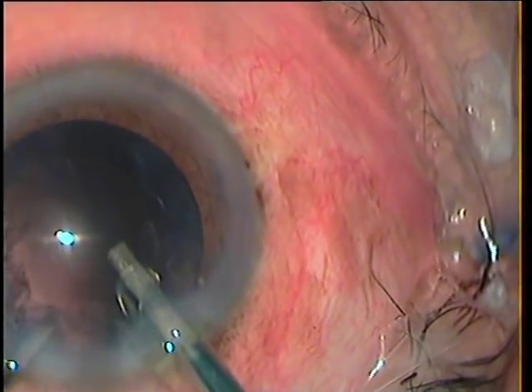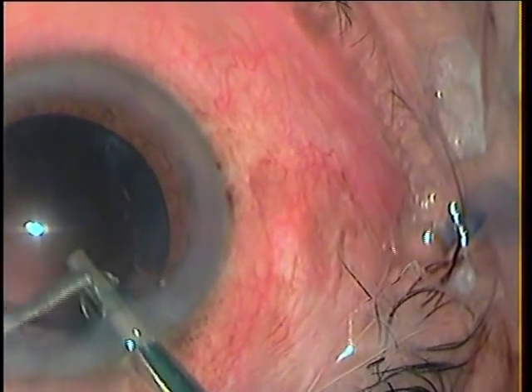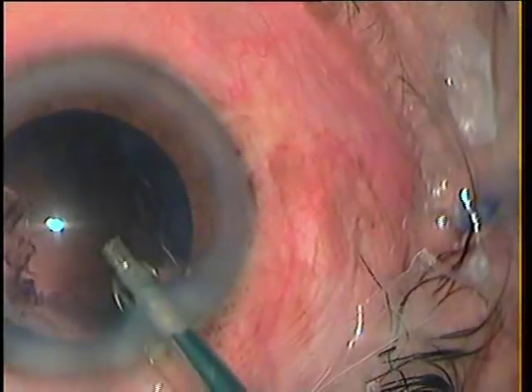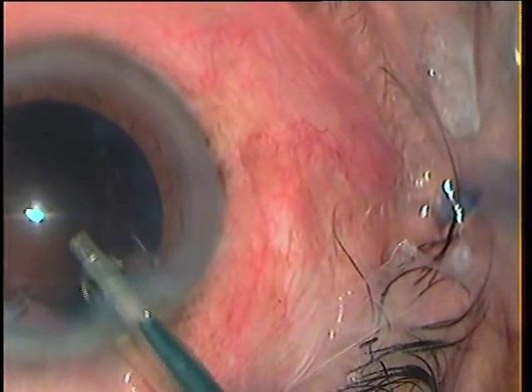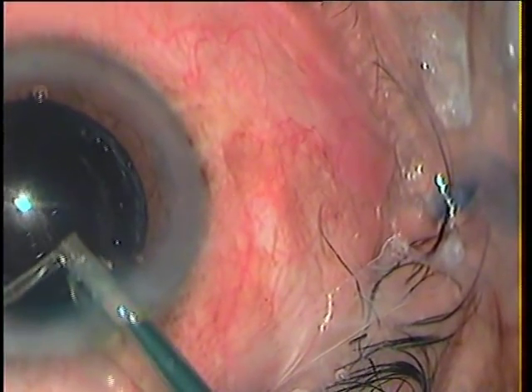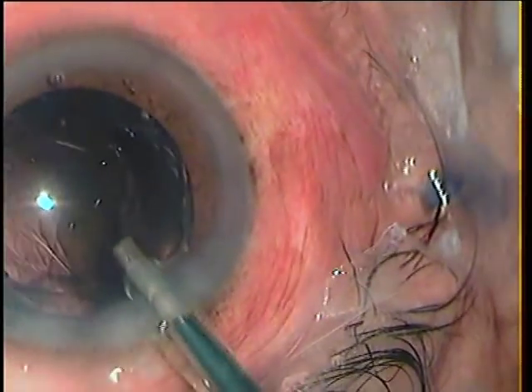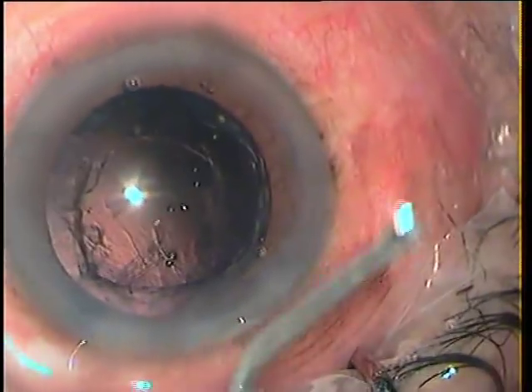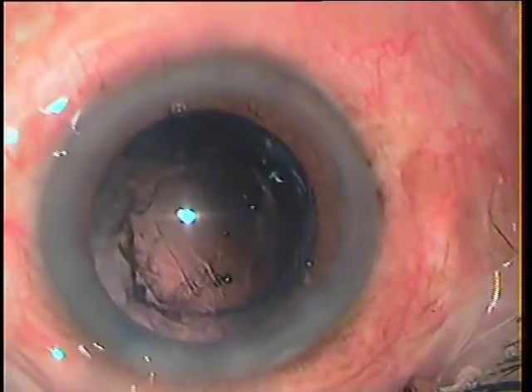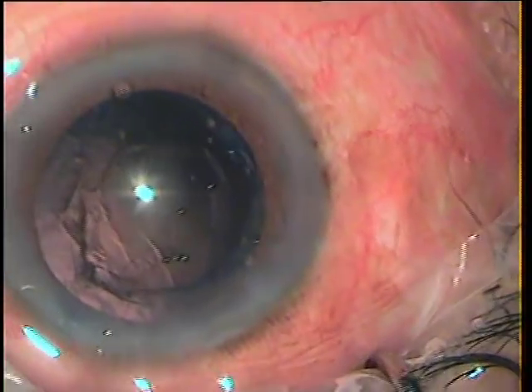Then I realize that I have ruptured the posterior capsule. Thankfully, after so many years, I don't have that adrenaline rush once I see a rent. So I keep the probe where it was, irrigation on, inflate the AC with viscoelastic, and then gently withdraw and assess. Yes, there is a rent — about 3 to 4mm, a bit radial. Thankfully, all of the nucleus is out, which could have been tricky.